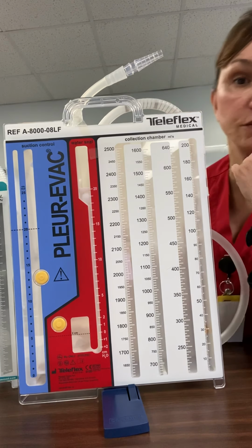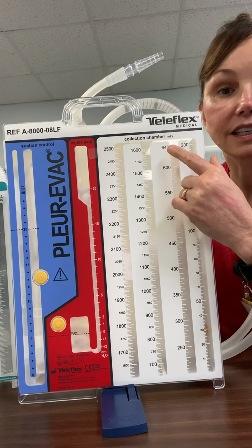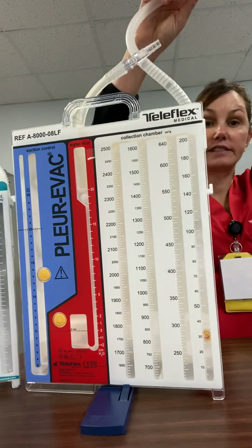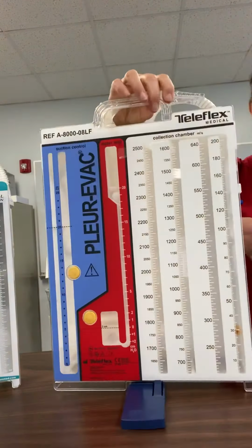The 3 bottle system. So this first chamber right here, this is the collection chamber. As you can see, this tube right here drains right into that. This gets hooked up to your patient. Okay, it's calibrated, so you can see little markings here. These are numbers. That's so you can do your I and O. So this goes up to 2,500 mLs.